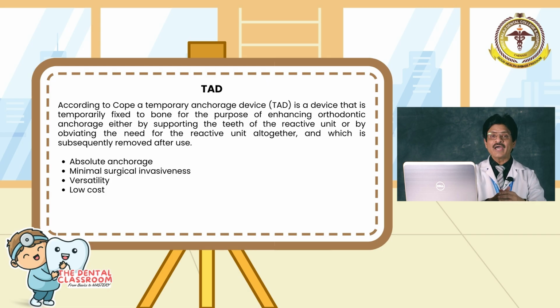So what we desire right now would be absolute anchorage, anchorage which does not move. You need to have minimal surgical invasiveness of the procedure. There should be good versatility, and of course, it should be of low cost.